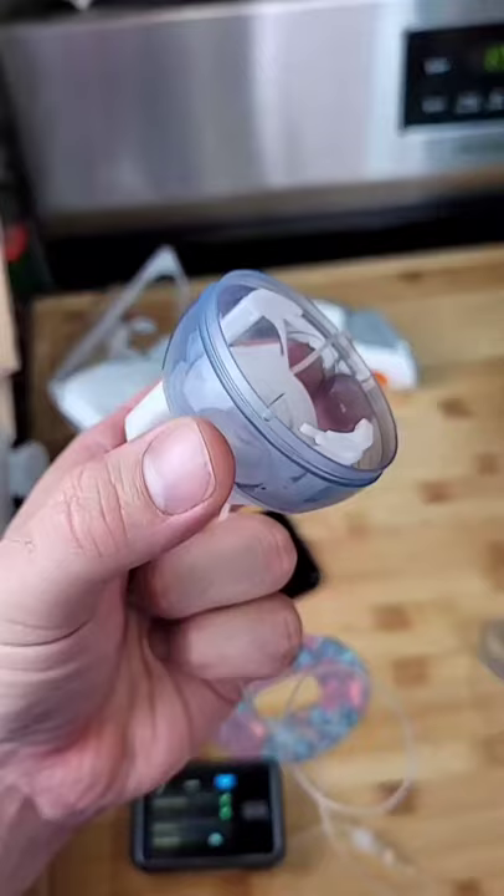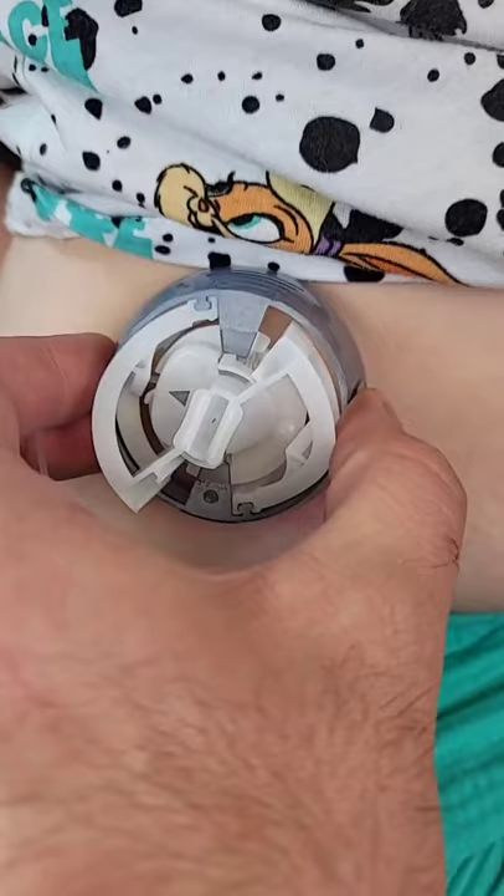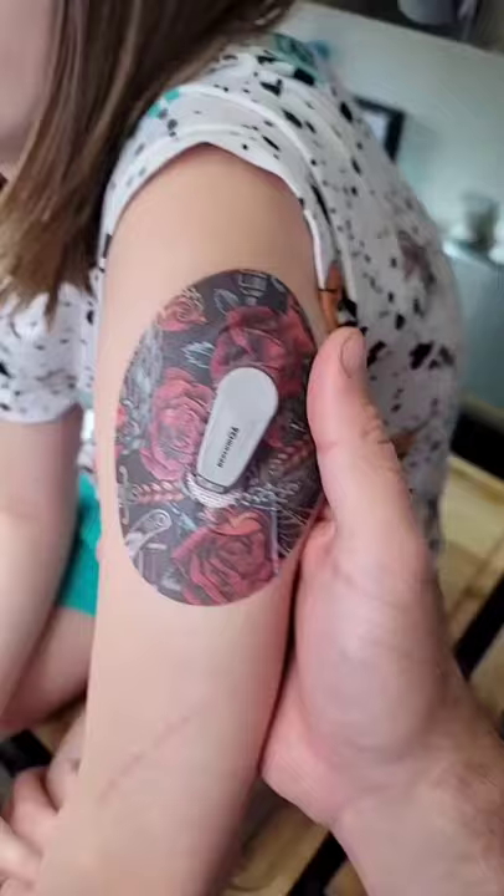Now let's stick her with the needle. One, two. Oh, there we go. Did that big needle hurt? And we're done. Resume insulin. Alright, I like this one a lot. You're a dive badass.